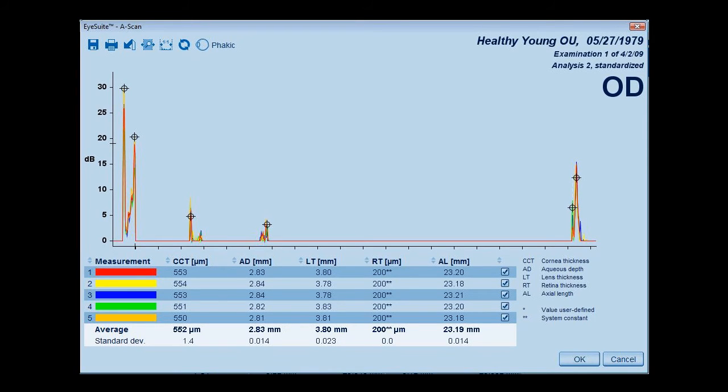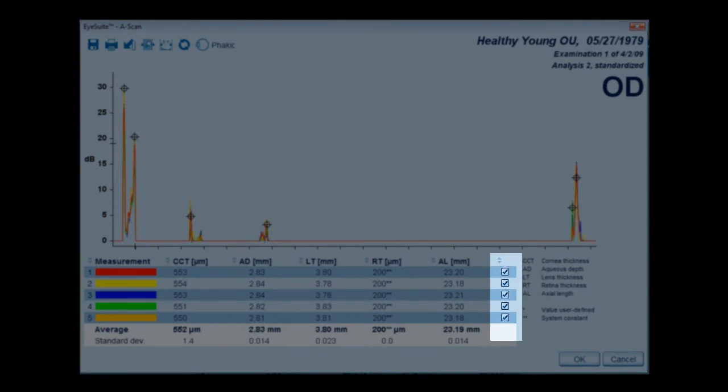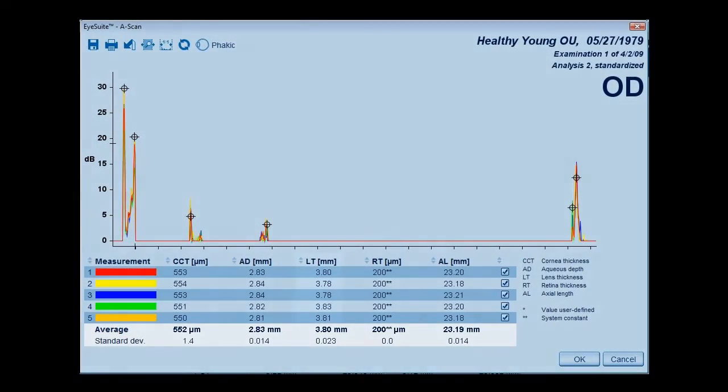The lens thickness values may also be excluded individually with a right click of the mouse. Measurement data can be excluded entirely by unchecking the box to the right of the measurements. Excluded measurements will remain in the database and are not permanently deleted.